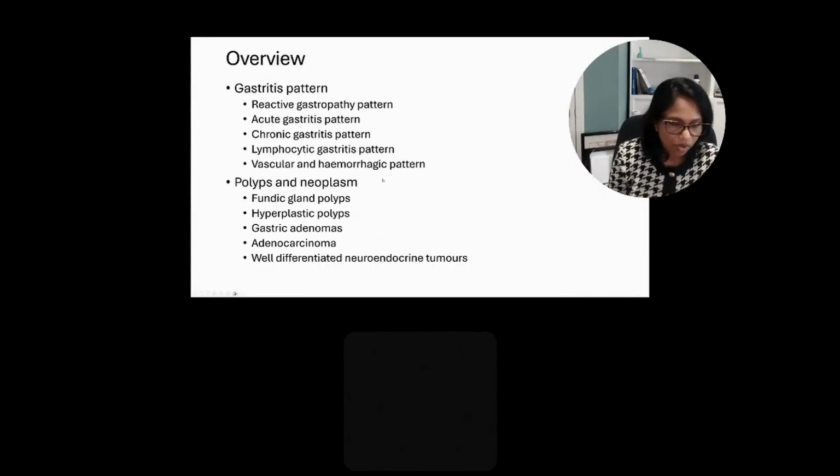So obviously, within the remit of this webinar, I won't be able to cover every single entity that we may come across in the gastric biopsy. However, I wish to focus on several common gastritis patterns that we may see, and also polyps and neoplastic processes that we might see more commonly or more typically in your everyday practice.